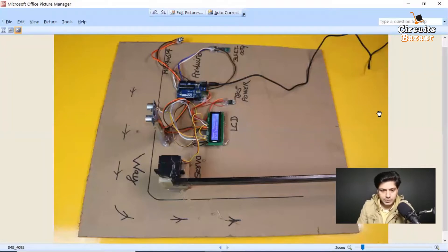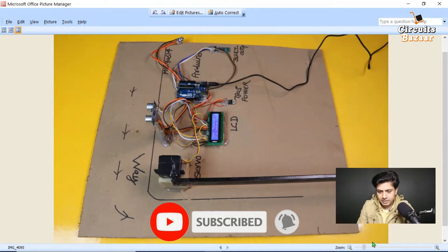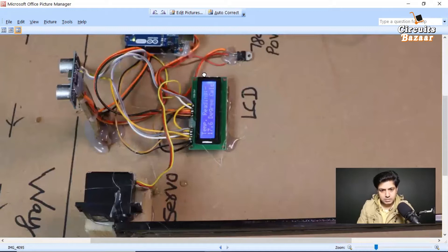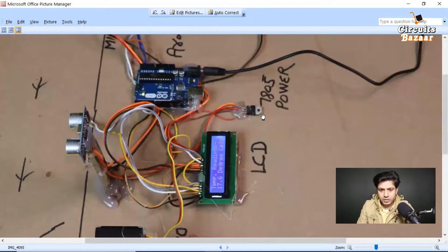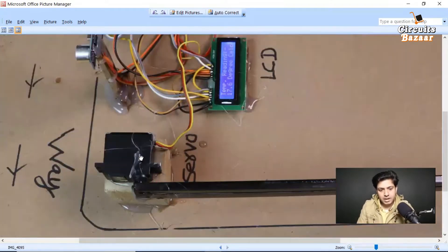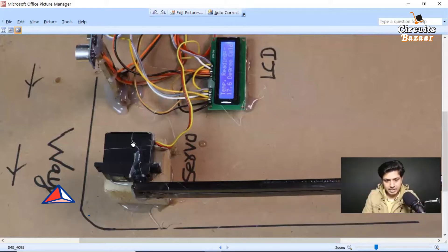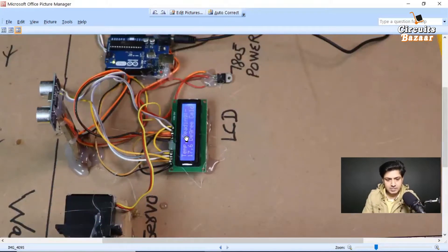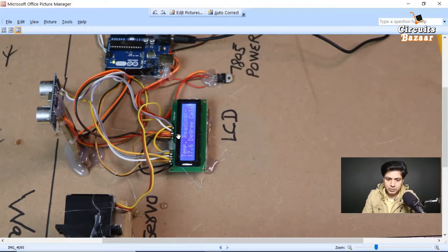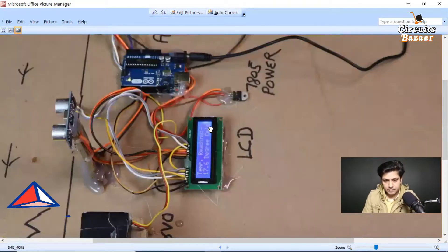This is the Bluetooth module, and this is the MLX90614 temperature sensor. This is your Arduino board. This is the 7805 voltage regulator, which provides a separate power supply to the high-torque servo motor. The servo motor controls the barrier. On the LCD, we display the temperature of the person, so the person can see their own reading. The temperature is also wirelessly sent to the Android mobile phone.